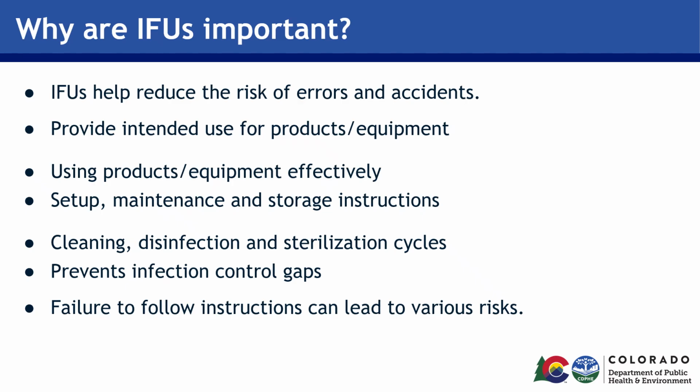Failure to follow such instructions or misuse creates significant risk to safety, quality care, and can lead to risks of infection and/or complications for patients. It's also important to understand that risk of infection associated with failure to follow IFUs may lead to patient notification events that may be costly and have consequences for a facility, including reputational harm.